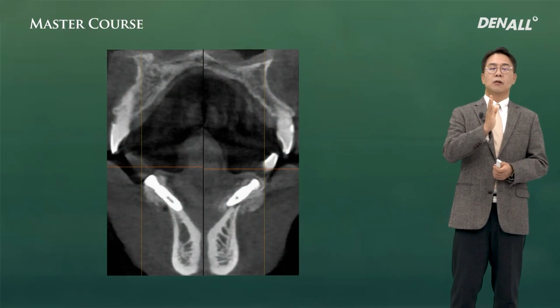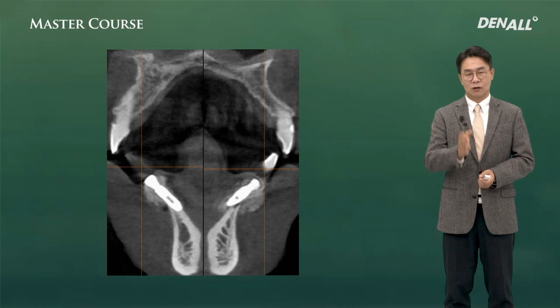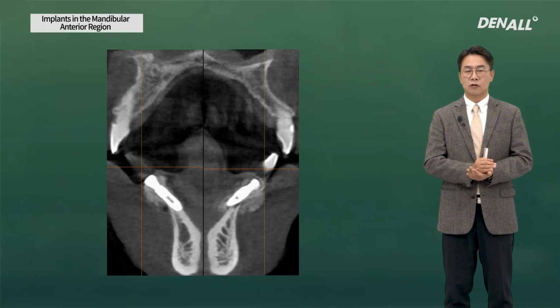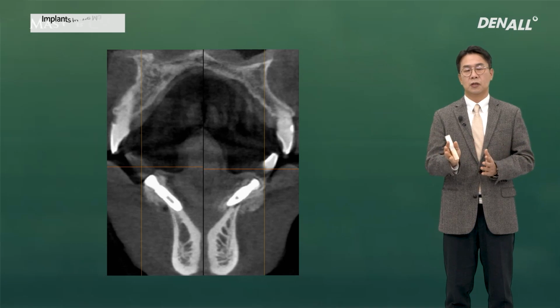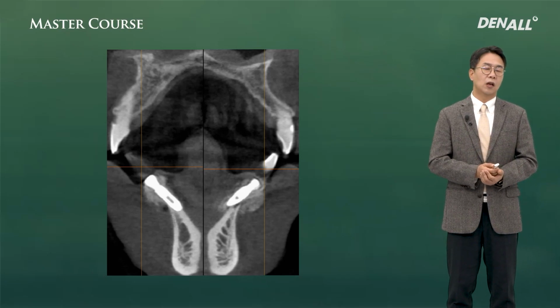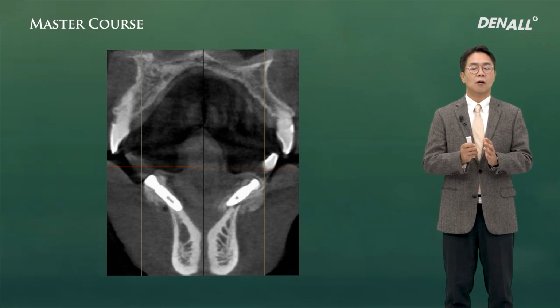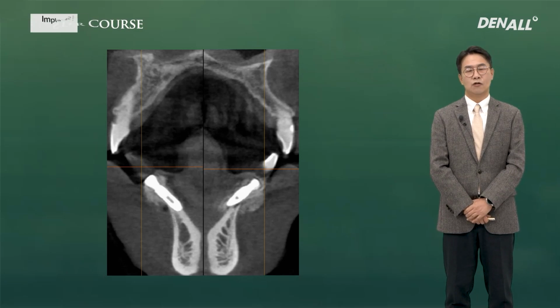We took great care. However, it is very much inclined lingually when we wanted to place the implants, but it was a situation where the implant would be inclined labially. Number 41 was okay, but for 31, the inclination was not good. How can we prevent that from happening? This can happen anytime. So we need to reduce the error rate of making this mistake. So the drilling point is very important for that.